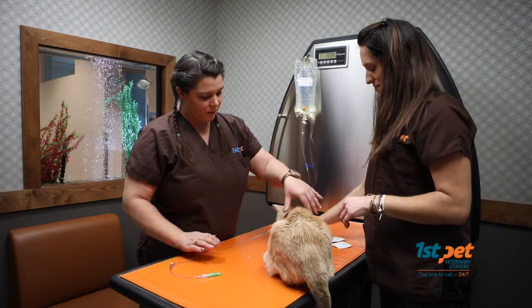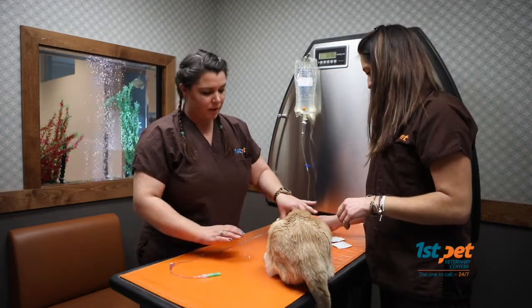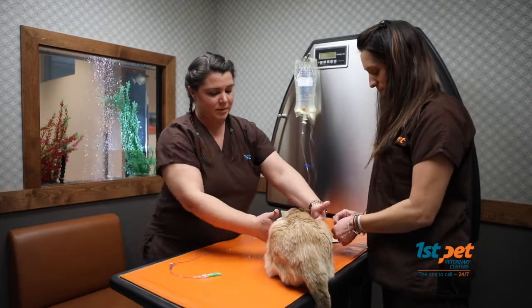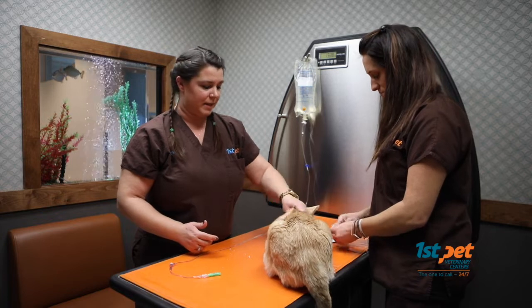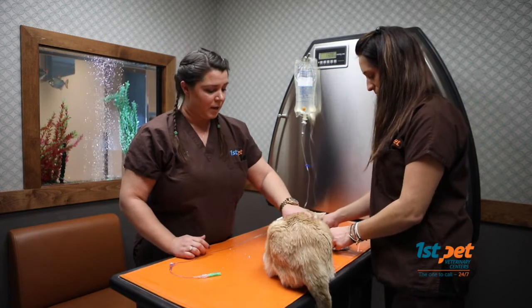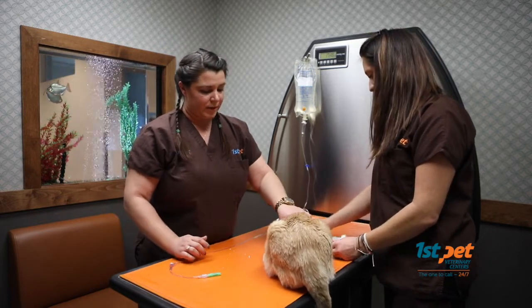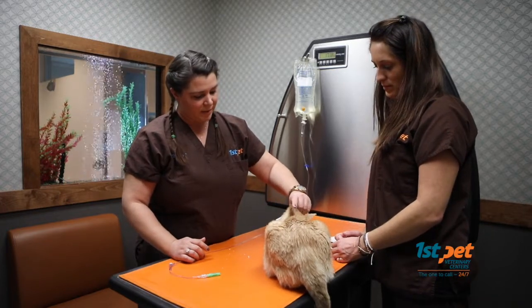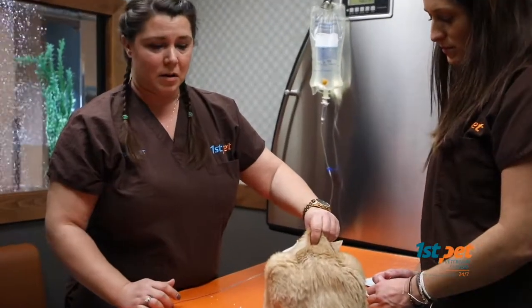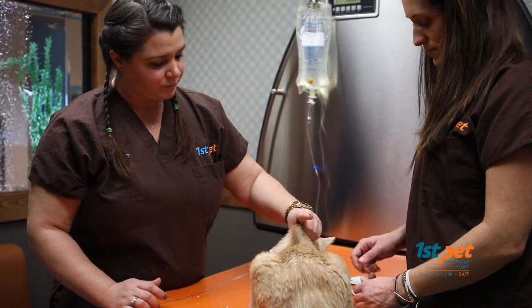So on kitties, we want to make sure that we're going from their collar area to the back of their shoulder blades. This is where they have the most area for their skin and the scruff area. When grabbing them for the fluids, you want to grab a good chunk. And you can see with my finger here, this is making what I call a teepee tent.